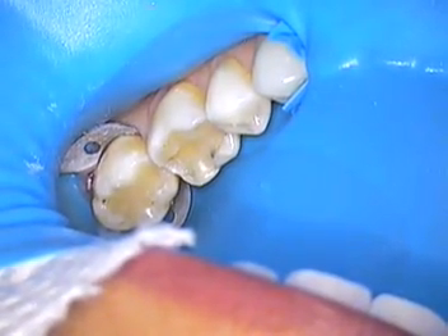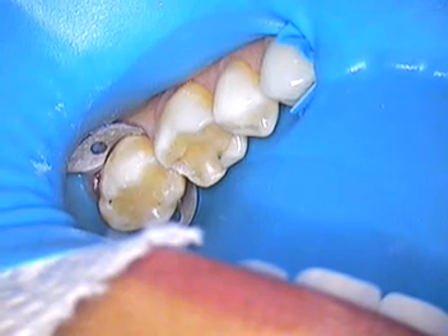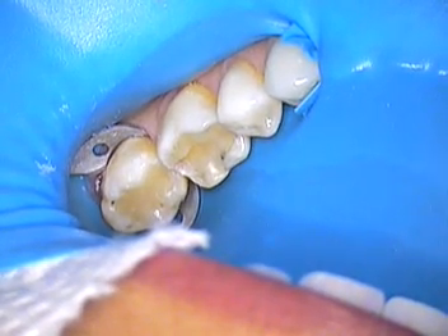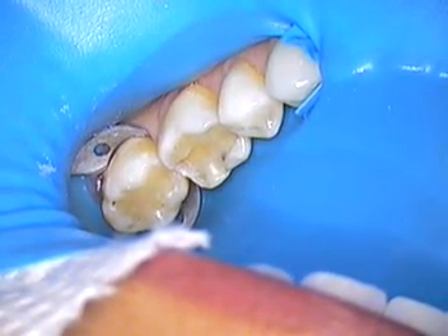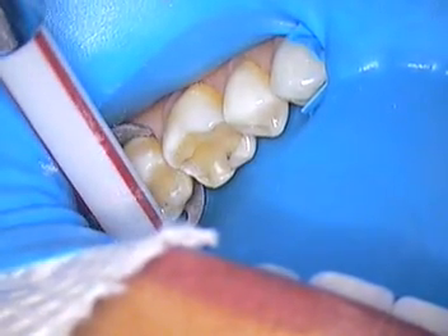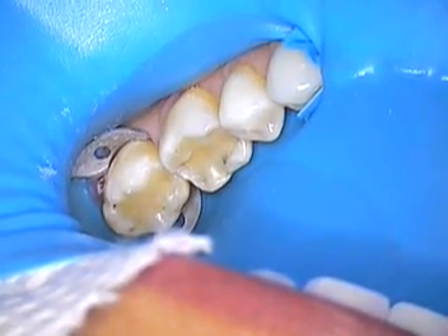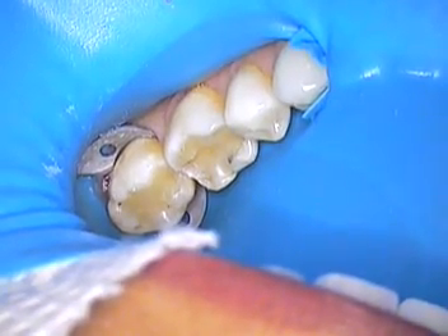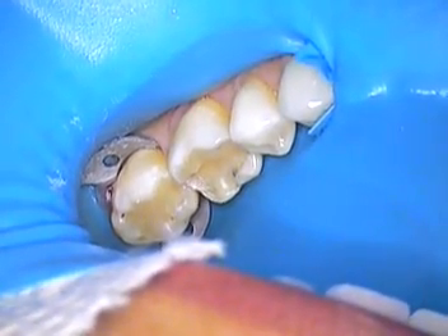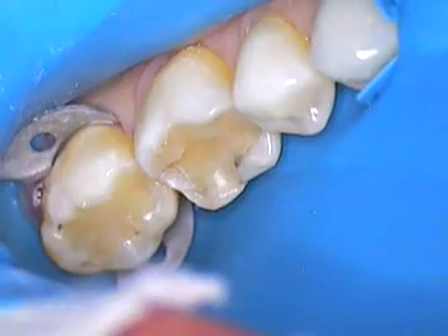Hello everybody, this is Dr. Jerry Cuomo back with you again in another procedure. Today we're working on teeth numbers 17 and 18, which are located in the 18 and 19 position due to orthodontics. We're not only going to change out these composite restorations to all ceramic, but we're also going to alter the patient's tooth morphology so that she would have much more function. We've already started, but the patient felt a little with the procedure so we had to re-anesthetize. This is using a stereo zoom microscope and we're going to zoom in to about 5 power.